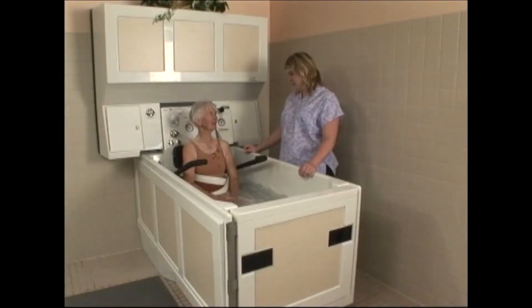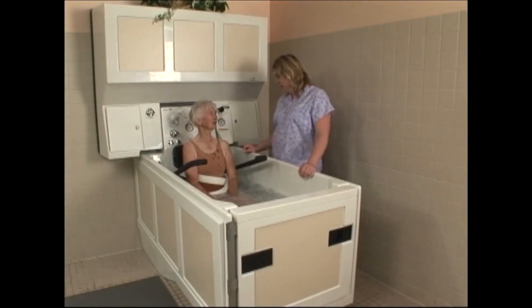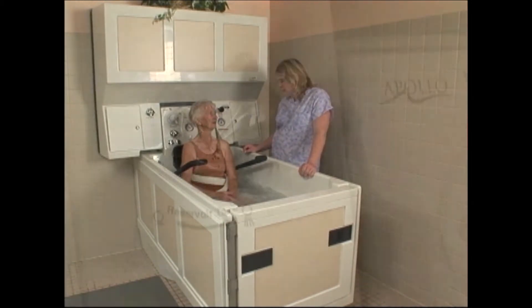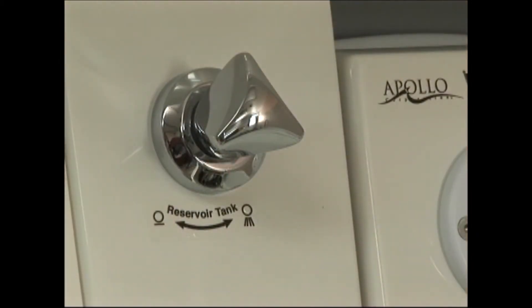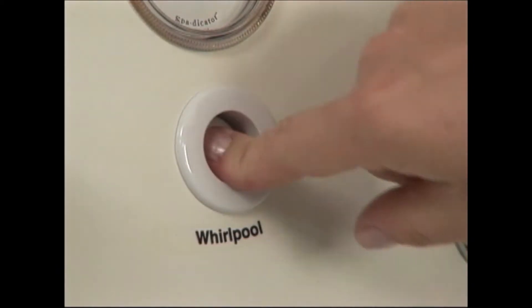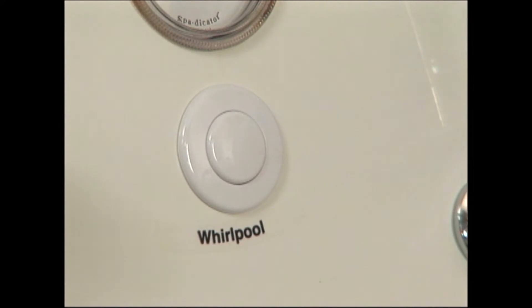When all the water is drained from the reservoir, push the black slide handle back in so that the reservoir will fill for the next bath. If no other baths are to be given, be sure to turn off the reservoir fill valve.